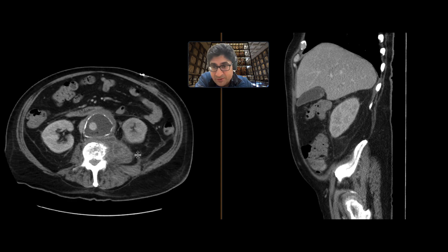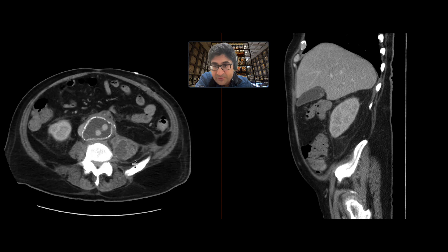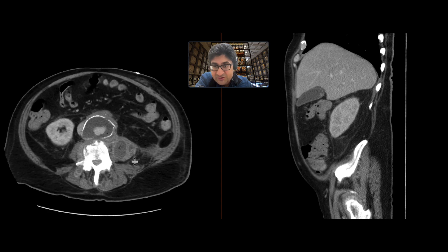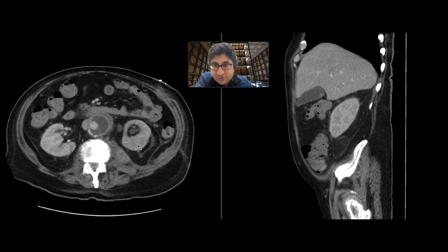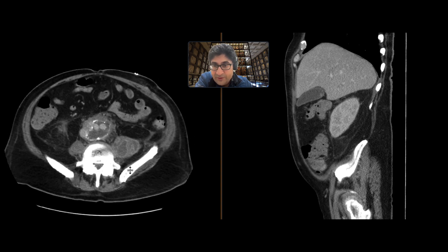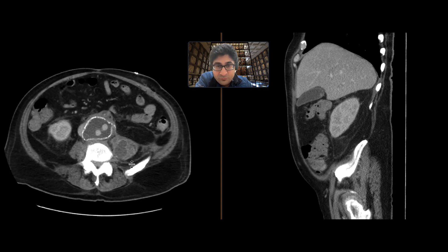We can see that in the psoas muscles there are these rim-enhancing collections containing gas as well. The goal then is to figure out what's going on, what's the epicenter, and what's causing all this infection.